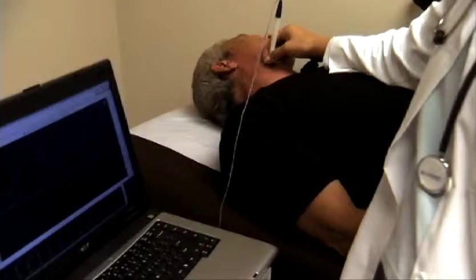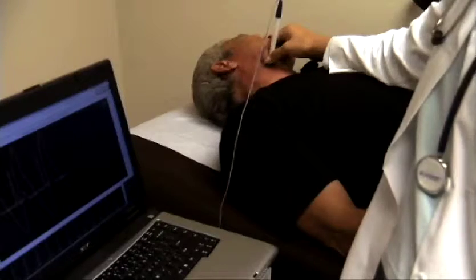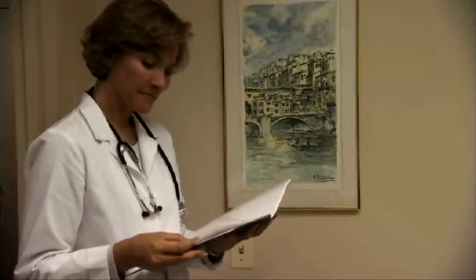In most cases, pulse wave velocity studies are performed to assess the stiffness of the aorta, measuring the speed of the pulse wave between the heart and the carotid and femoral arteries. Please refer to your study protocol to determine which pulse locations must be measured.